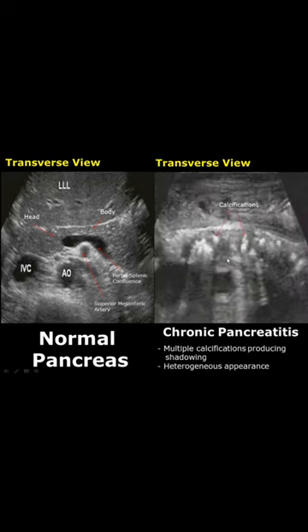In chronic pancreatitis, there is calcification of the pancreas, and it leads to hyperechoic calcifications which produce shadowing.